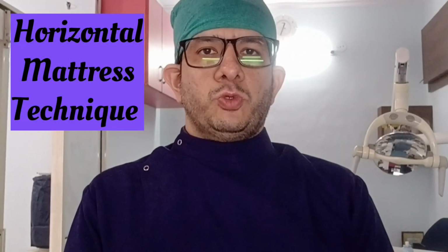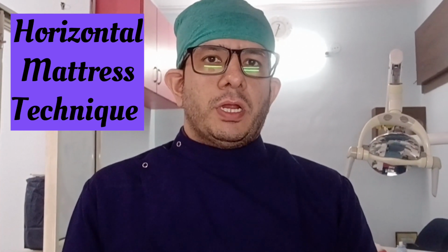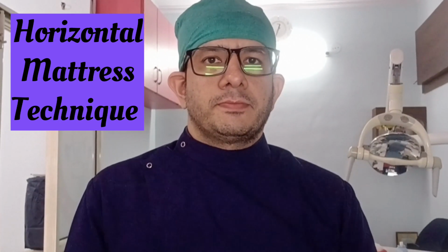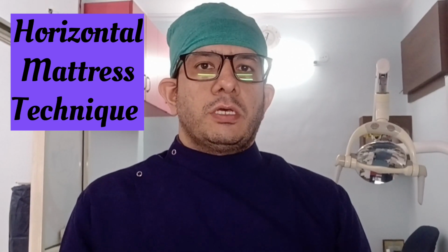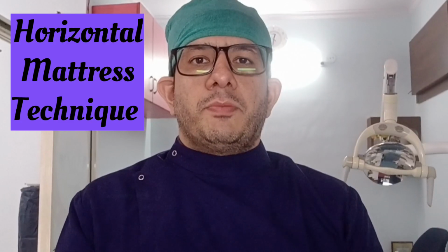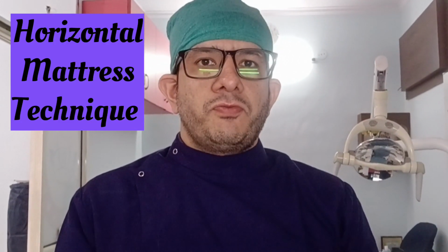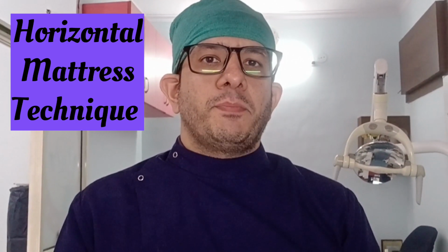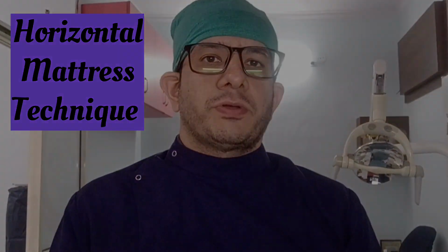Indications for horizontal mattress suture technique are large distance between the tissues, implants, bone grafts, and closure of extraction socket. Advantages are that it provides good hemostasis and it causes less prominent scarring. Disadvantages are: number one, it can cause strangulation and skin necrosis if it is tied too tightly. Second, it leaves a gap between the tissues. And third, it is difficult to remove.